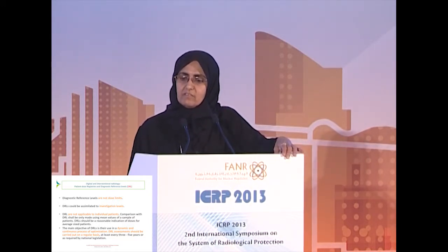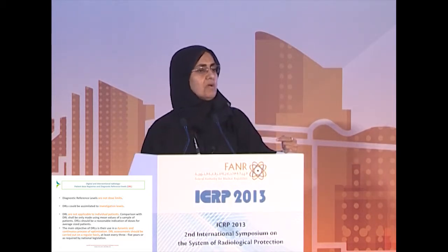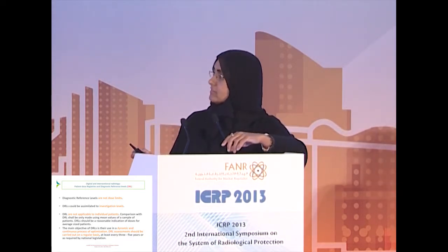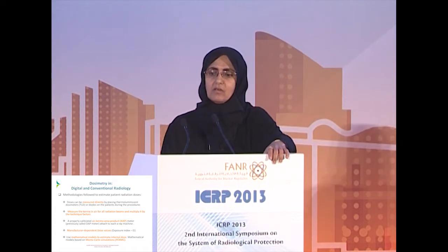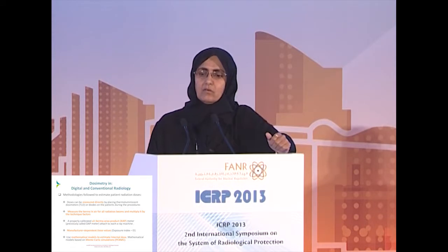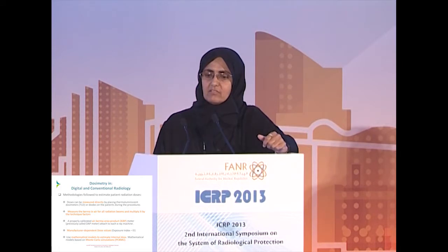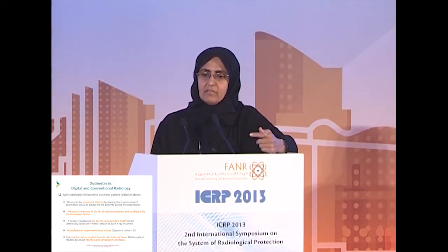The main objective is that it has to be a dynamic process, surveyed at intervals of years, like 3 to 5 years. In the UK, they go for 5 years. The methodology used for the evaluation is either directly measured, like with TLD or other sensors, but this is a very expensive and tedious procedure, or it goes by measuring the kerma in air and multiplying by the technique factors.